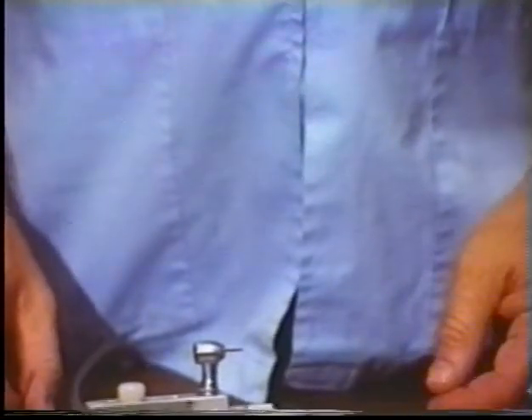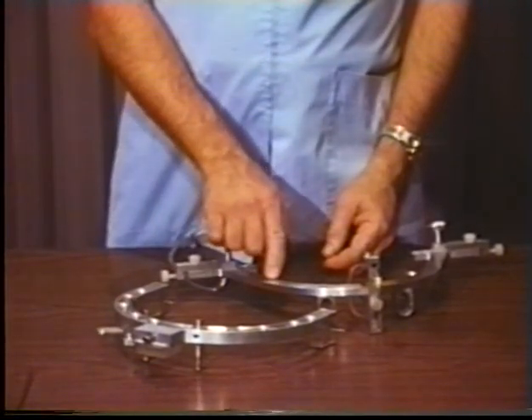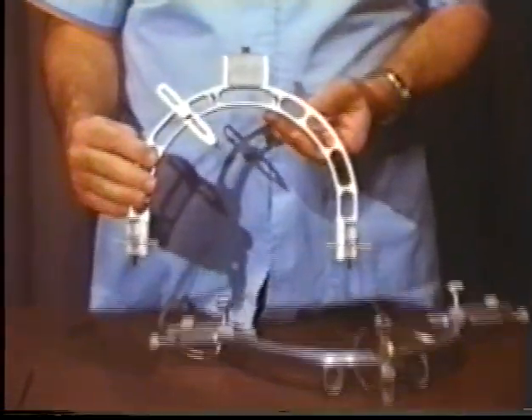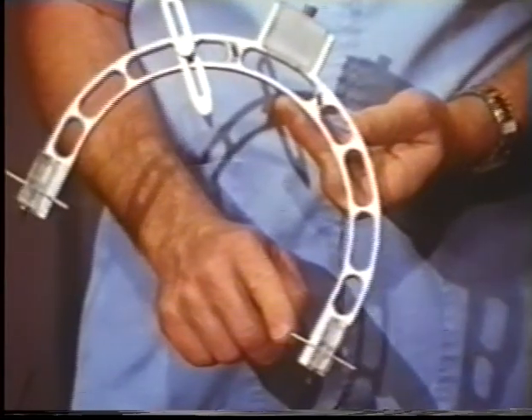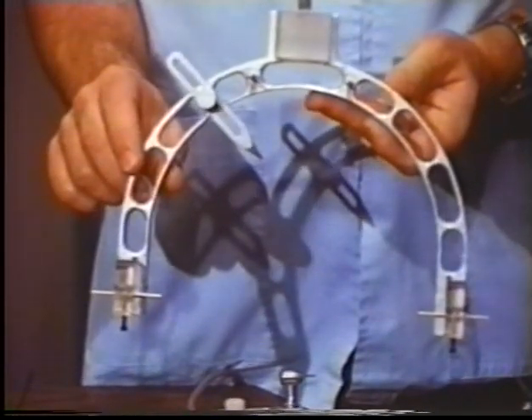The recording pantograph consists of 2 face bows. One is fixed to the upper jaw, and the other is fixed to the lower jaw to move with the mandible. The upper bow is a rigid, lightweight metal structure, which holds 3 clear polyester resin recording blocks in fixed spatial relationships to each other and to the orbital axis plane of the patient's head.